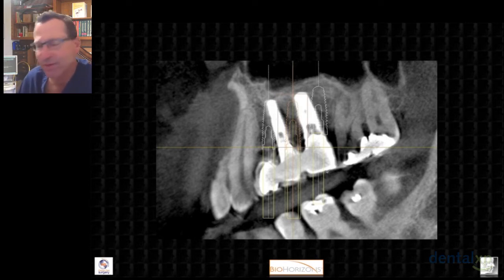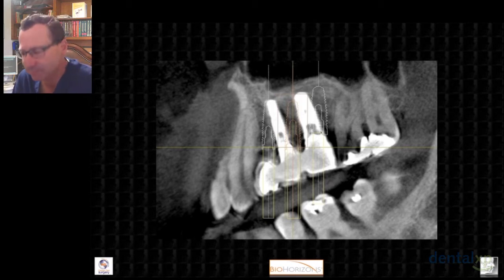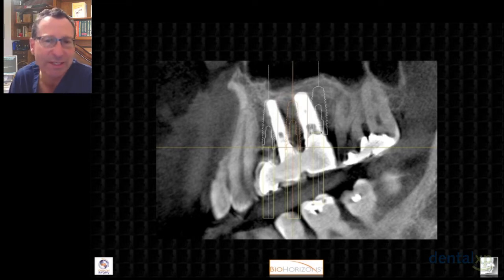I don't really want to do that, but it just goes to show that even with a good clinical team, an experienced prosthodontist, experienced surgeon with 3D imaging and a model-based surgical guide, that implant placement can be less than accurate.